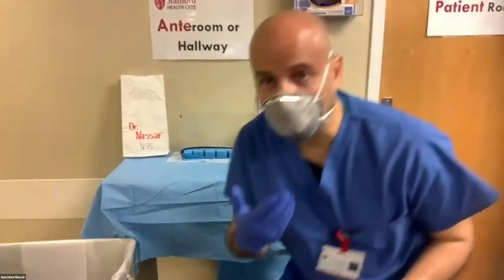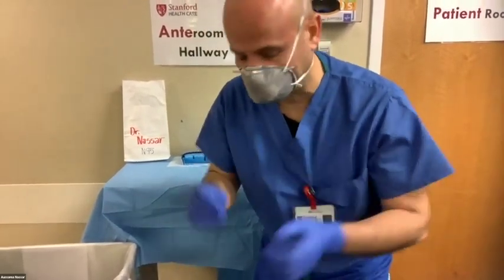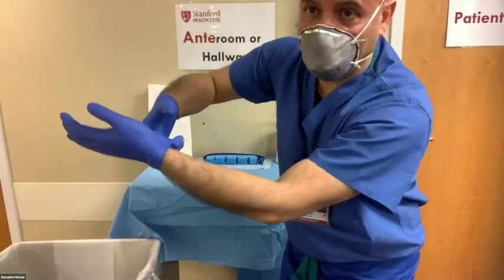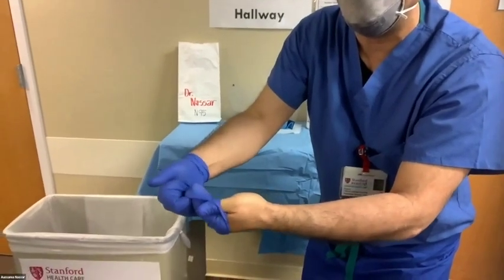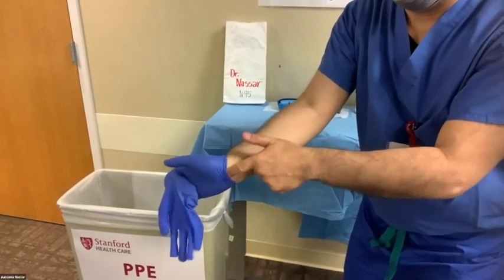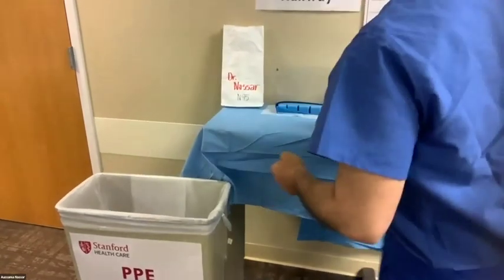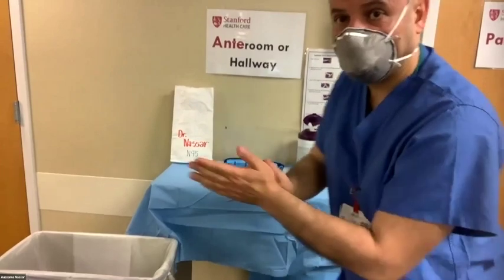Now reusing the N95. Remove your gloves — try not to touch the outside of the gloves as much as possible. You're removing those because they're contaminated from cleaning the face shield. Perform hand hygiene once more and then put on clean gloves.